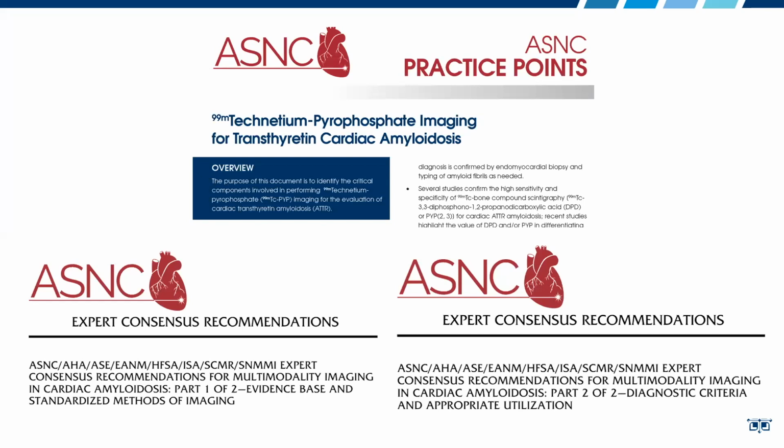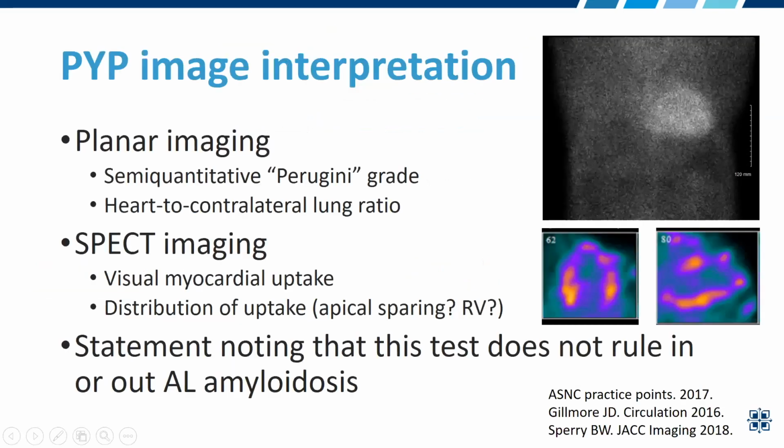As far as how to read, interpret, and report these studies, there are again multiple documents led by ASNC that you can look at. Part 1 of this multimodality imaging document has a lot of information on this, as well as the ASNC practice points. All of these have been updated little by little as new data has come out because this is a rapidly evolving field.